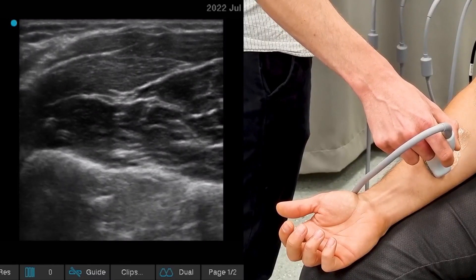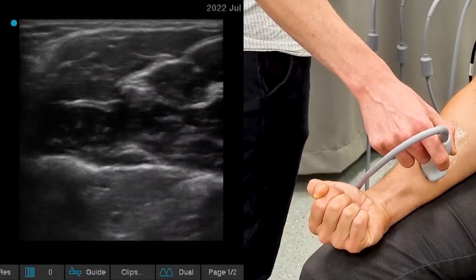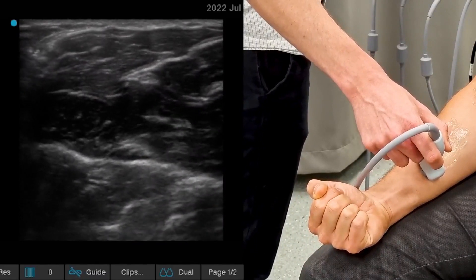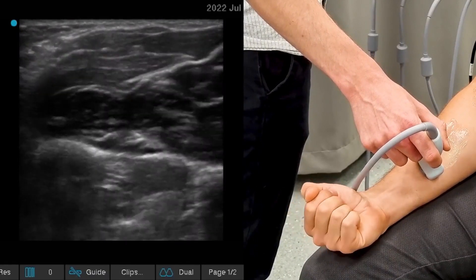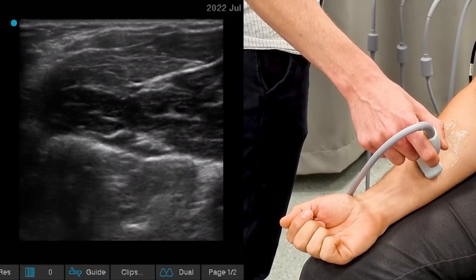If we instead ask him to keep his fingers still but flex his wrist, we can see the movement of flexor carpi radialis. In this video, we saw the bones and muscles of the elbow and anterior forearm, firstly on a model and then on a real patient. We also saw ultrasound of the antecubital fossa and the muscles of the anterior forearm on ultrasound.